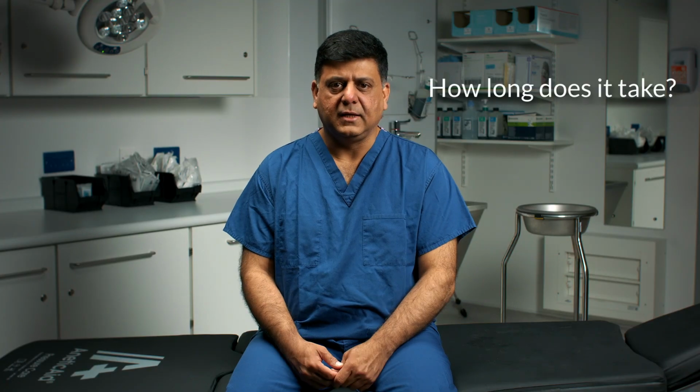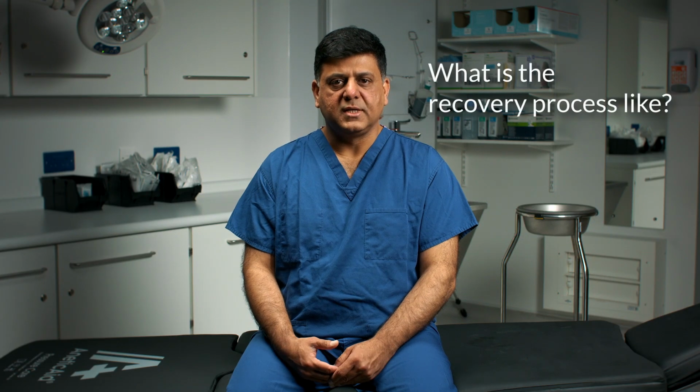How long does it take? A flexible cystoscopy usually takes only around 5 minutes or less to perform. Is a cystoscopy painful? A cystoscopy should not be painful, but it can feel slightly uncomfortable. You might also feel like you need to pee during the procedure, but this will only last for a few minutes. You can also tell your consultant if you feel any discomfort and they will stop the test at any time.